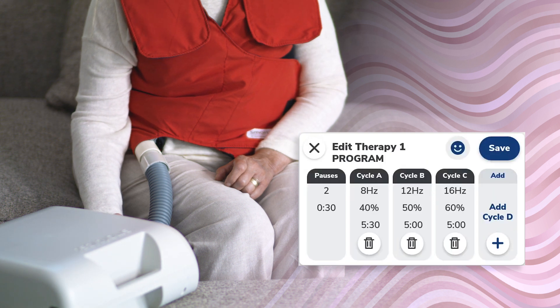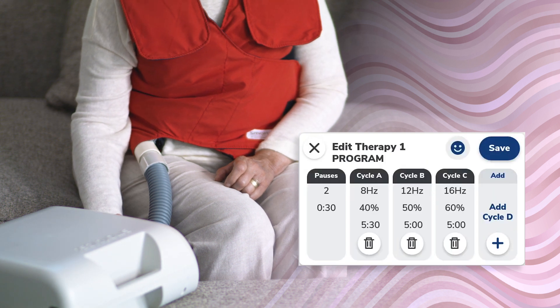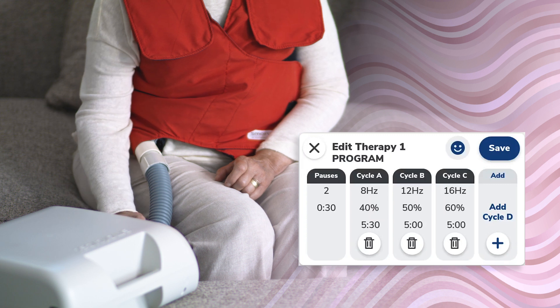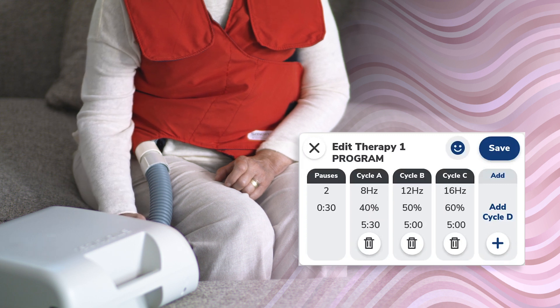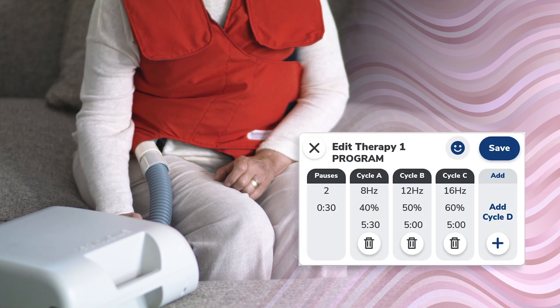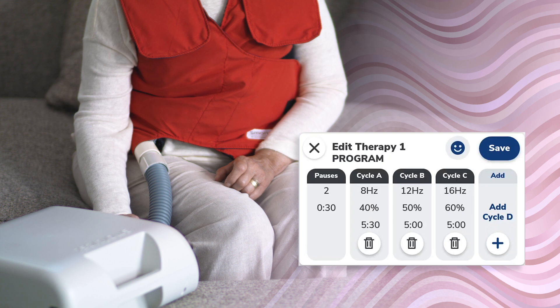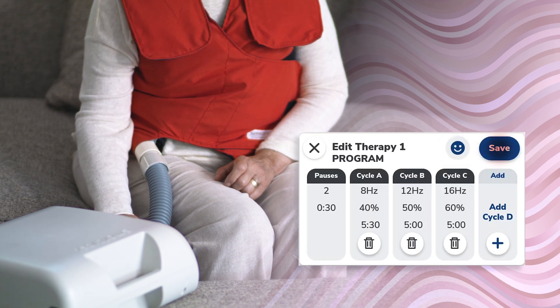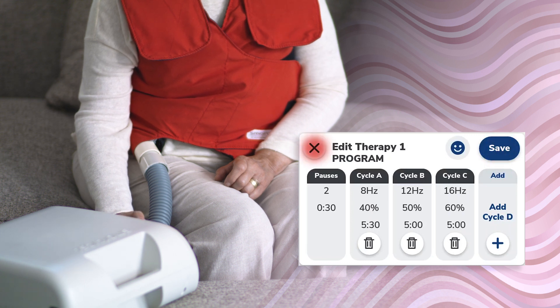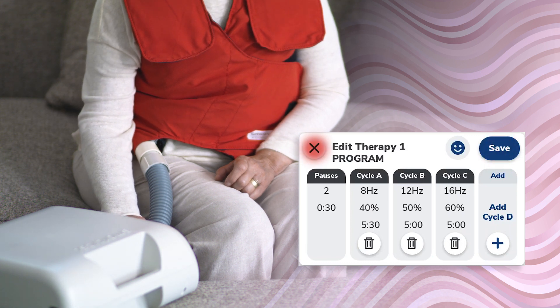To make changes to the program's pause settings or a cycle's frequency, pressure, or duration settings, tap anywhere on the gray pause or cycles boxes. Changes can also be made to the therapy's label by tapping on the label icon. Tap on the save button to save the edits, or tap on the X to exit without saving edits.